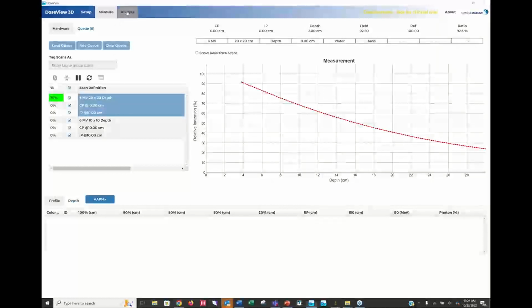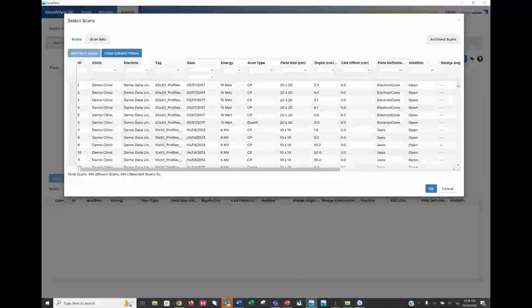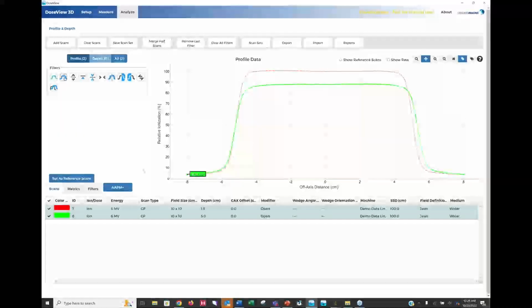While this is scanning, I'm going to jump into my analyze, and I'm going to pick a couple scans to load here. Let's see, maybe a couple of 6 MV scans, just to show you. So here I've got my scans. Nice thing too, I can set some reference.